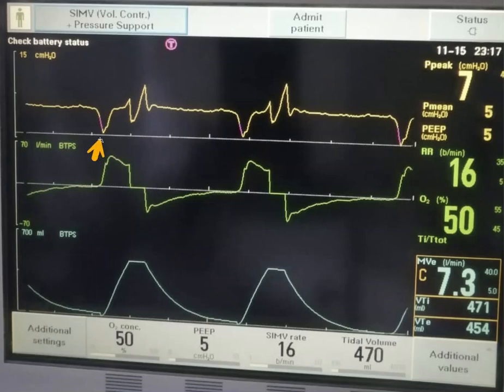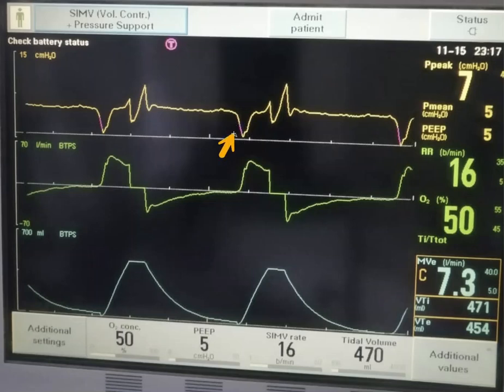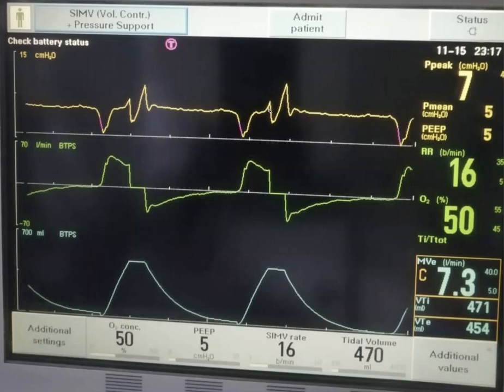So this is the first breath and this is the second one. You can see it's about 3.6 seconds between them. The patient-initiated efforts are indicated by the pink color here. The machine synchronized the mandatory breath that was supposed to happen at 3.75 seconds with the patient's effort and gave it a bit earlier.